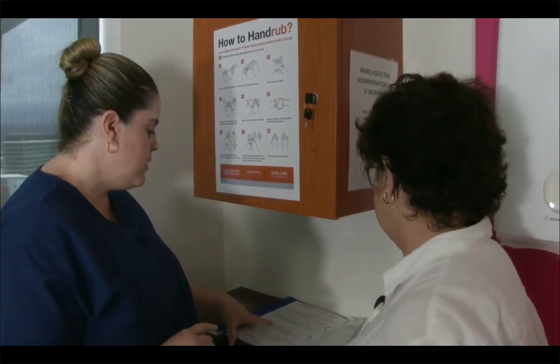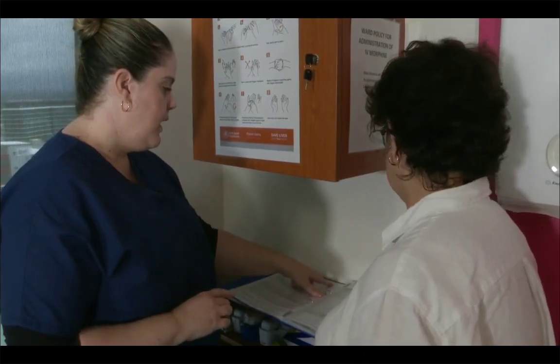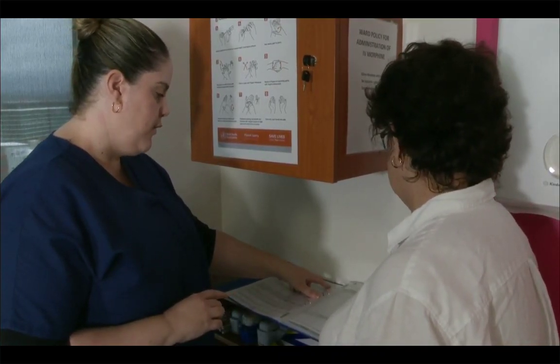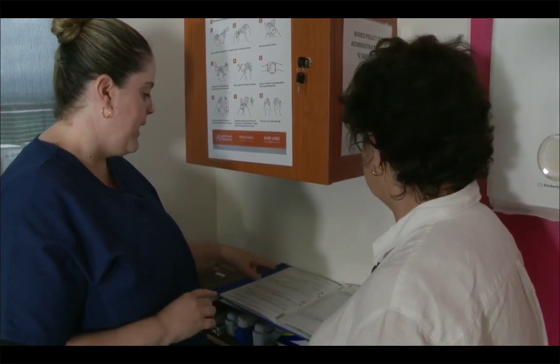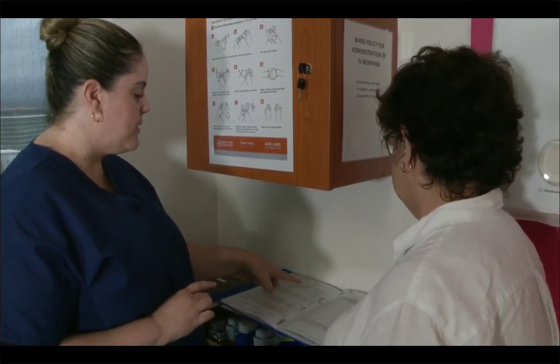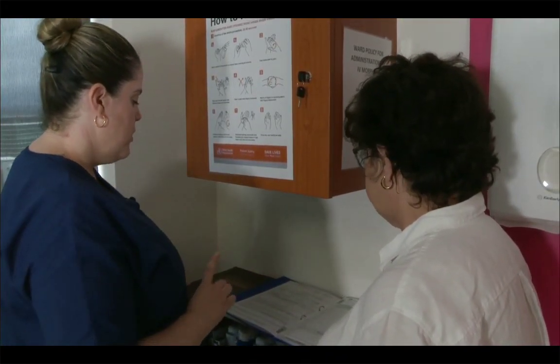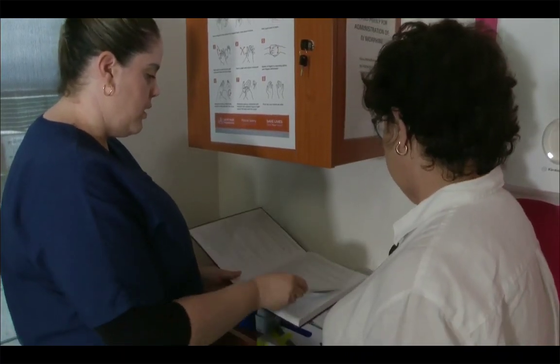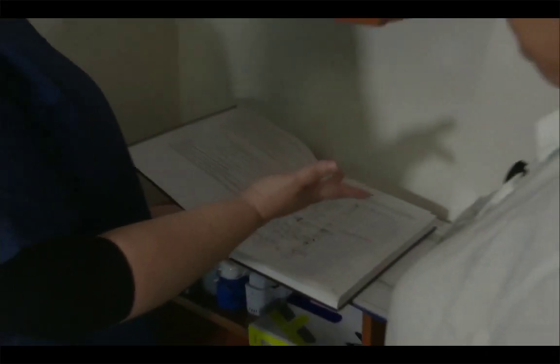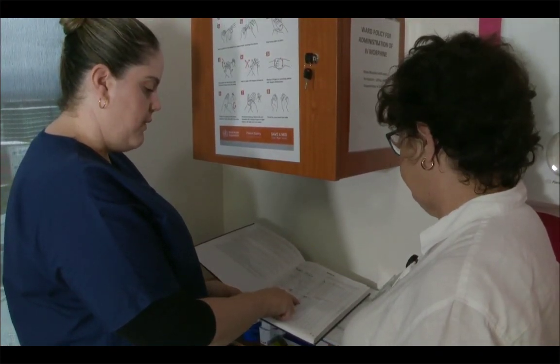Okay, Marianne, so we're just going to sign out some. I've got the order for PCA for John Bryant, 2017-05, date of birth 13th, 3rd, 48, no allergies. The medical officer's written him up for IV fentanyl, 1000 mics to go in 100 mils of sodium chloride, concentration of 10 mics per mil. Yes. So just looking at the book, I think our best option is probably our fentanyl 500 mic amps in 10 mils. It's the biggest concentration we've got. So that'll just be on page 74.